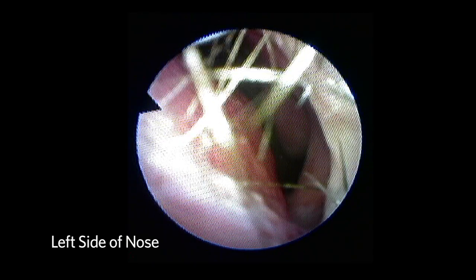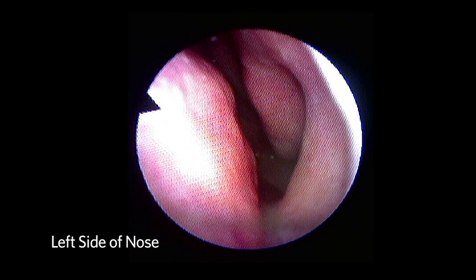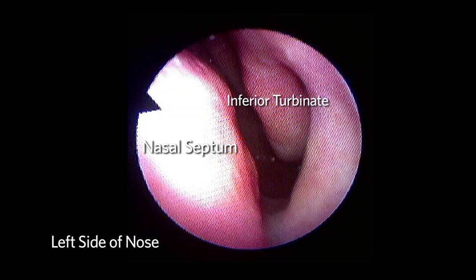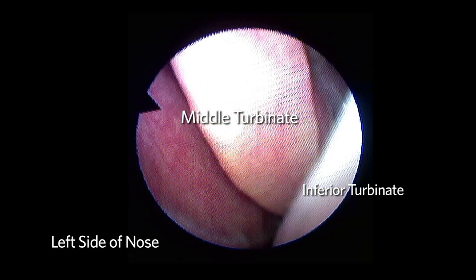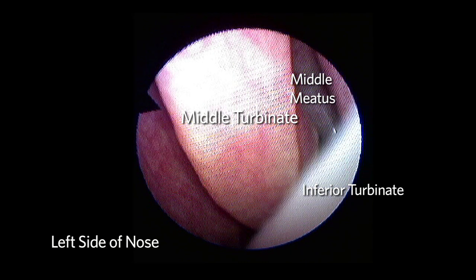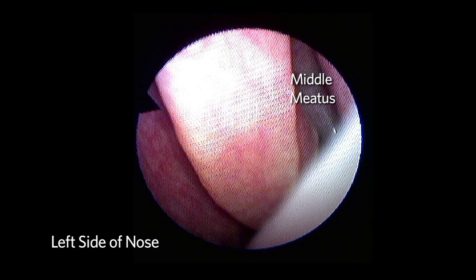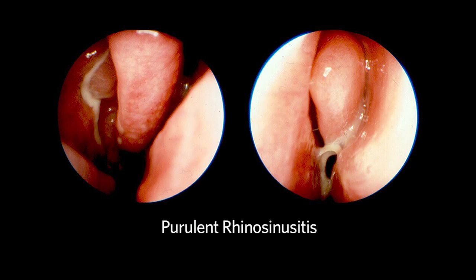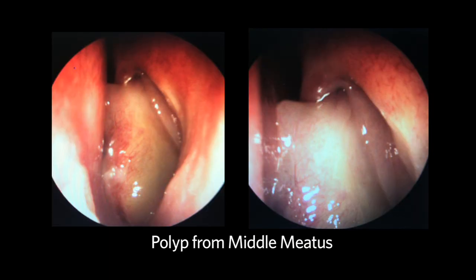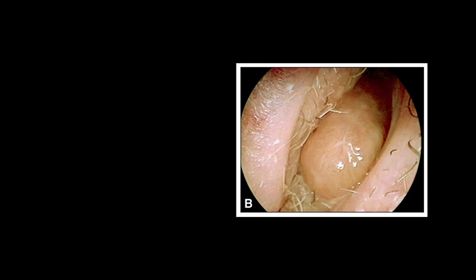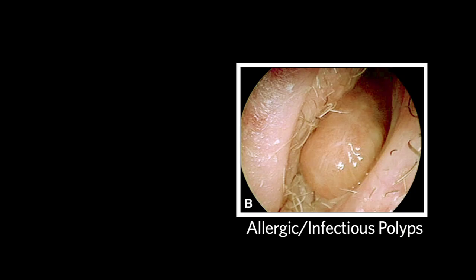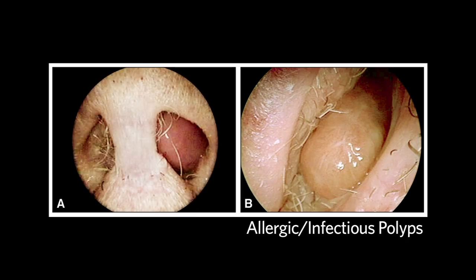The scope is placed into the nasal vestibule and, starting along the floor of the nose, one sees the entire length of the nasal septum and the inferior turbinate. Raising the scope 30 degrees allows visibility of the middle turbinate, the inferior turbinate, and the middle meatus. The middle meatus is the area of drainage of the maxillary and most of the ethmoid sinuses. Any purulent drainage is suggestive of infection. This is the most common site for nasal polyps; however, nasal polyps can be so large as to obstruct the entire nasal cavity. Allergic or infectious polyps tend to be pale in color. If they are red or firm, it may suggest a tumor.